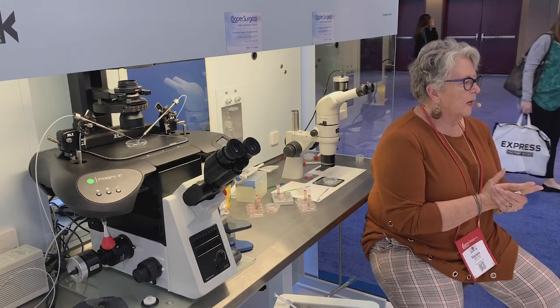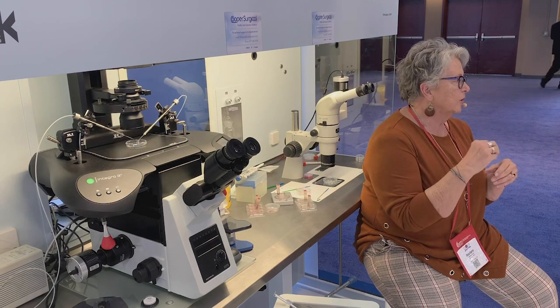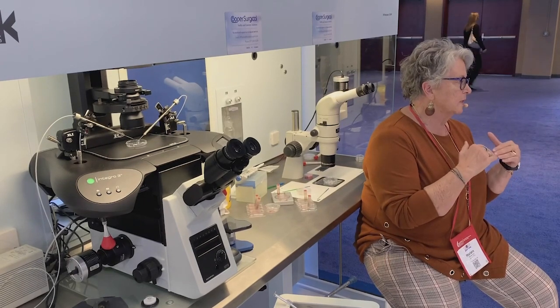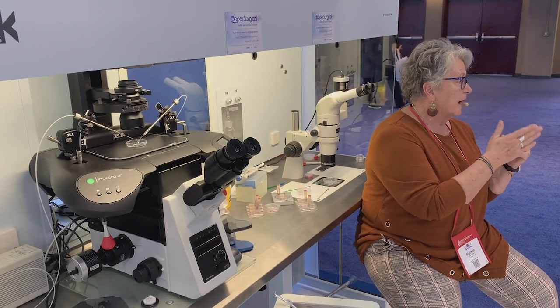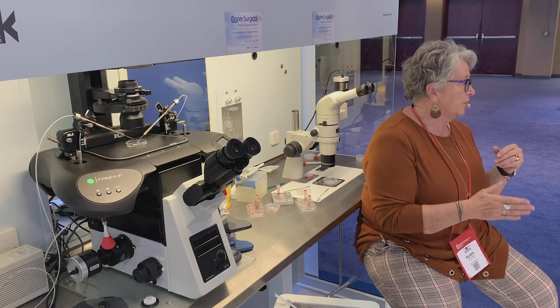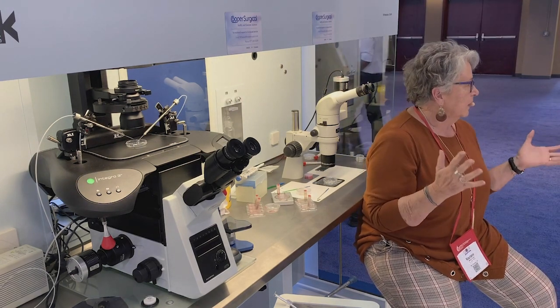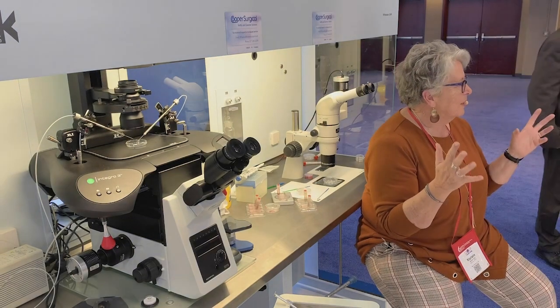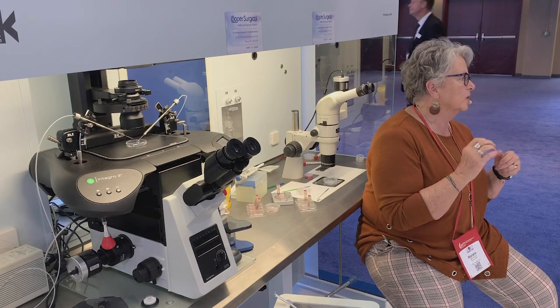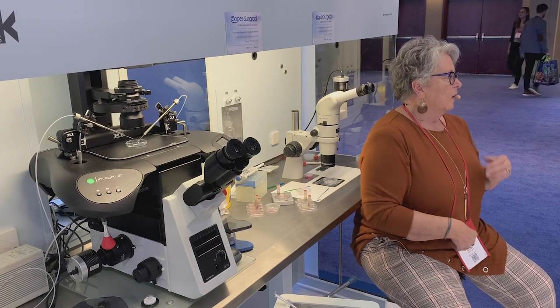The first thing is when any person gets and starts vitrification, you have to make a decision about how long your embryos are going to sit in that first ES solution. So vitrification, the process of freezing, is 2 steps. 5 to 15 minutes in the equilibration solution, and then a minute in the vitrification solution, then you load onto the device. So the first question is, do you really want to leave it 5 to 15 minutes? Maybe you want to make a specific decision about how long you want your embryos or oocytes to sit in that solution, and a lot of it will depend on what you're freezing or what you're vitrifying.